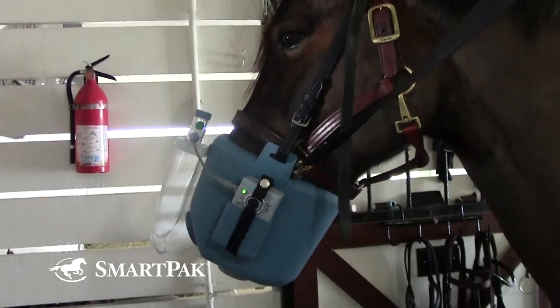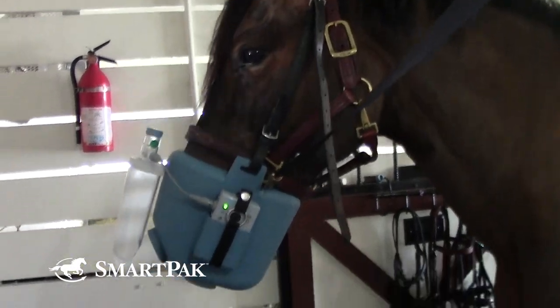When I first introduced the nebulizer to them, they both made big eyes at the blue bucket coming towards them, but then I put just a couple cookies in there, and now they get super excited when the nebulizer is coming.